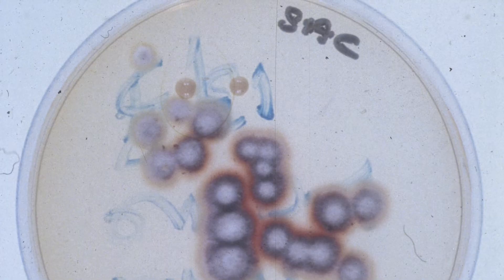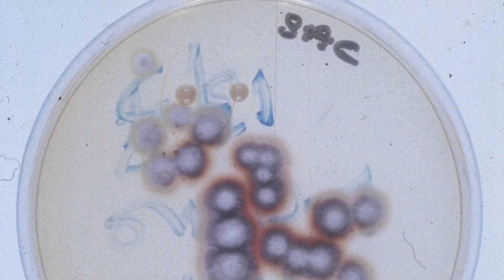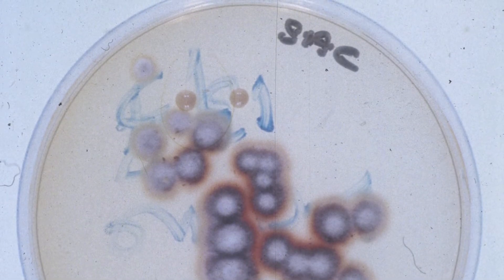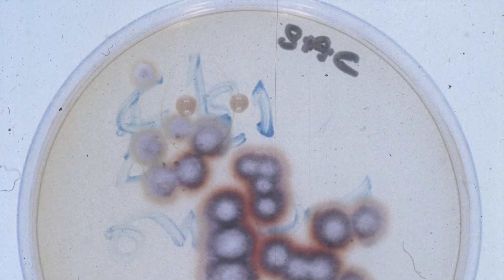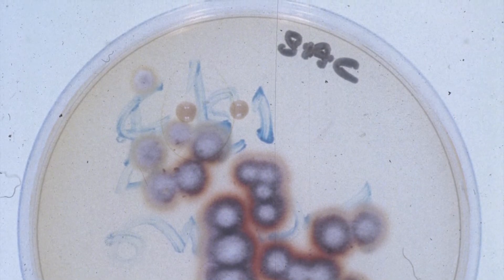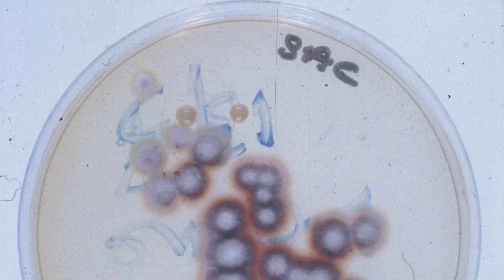It's important to take mycology specimens prior to initiating any antifungal treatment, either topical or oral. It's simple, quick and inexpensive.